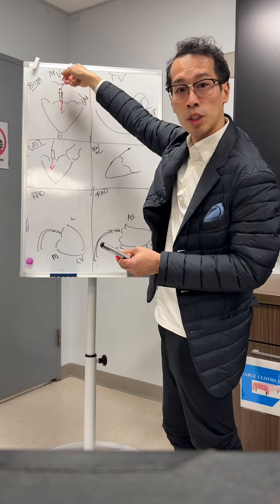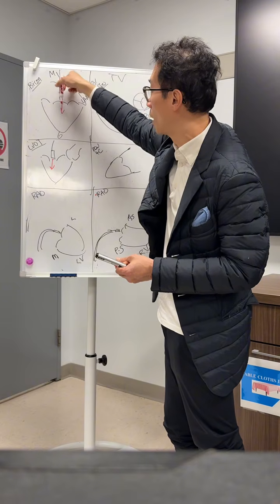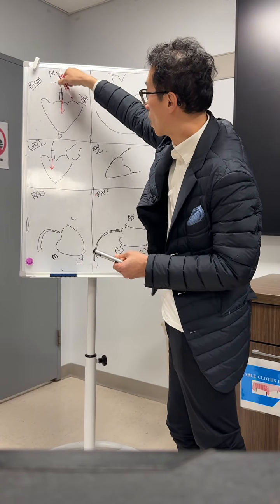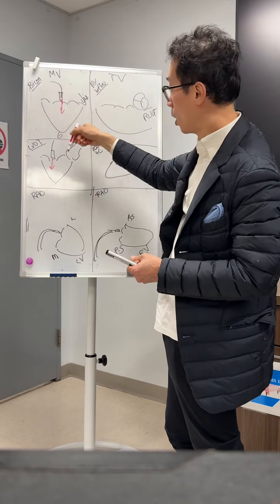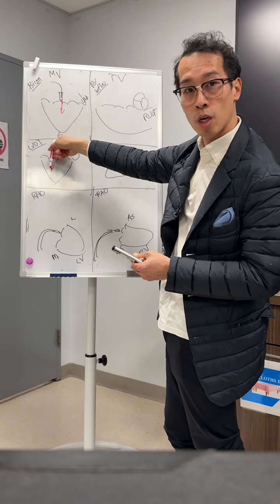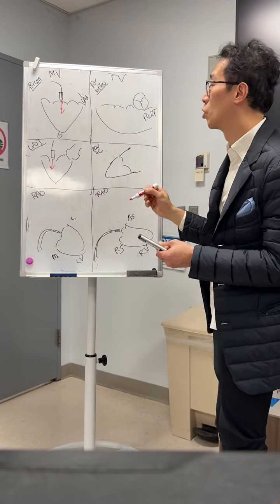So if you're going and you're watching, you're seeing yourself medial dive, what happened? You can correct yourself with less M. If you need to go more medial, but you're going straight, then you withdraw the whole system. If you need to advance the lateral side, you push in the whole system. And if you see yourself going in this way on your echo view, you have to add more M to go back. Here, this is more about anterior and posterior guide torque. So you should go in straight. If you see yourself going in this way, you need to go clockwise posterior on the guide. And if you're going towards the posterior wall, you need to go counterclockwise and go anterior on the guide. So that's what you need to do to do the steering.